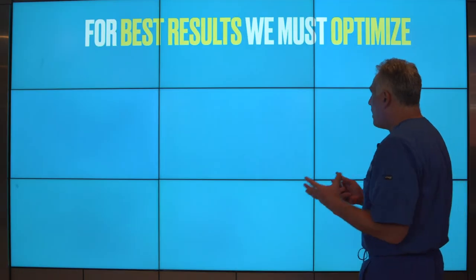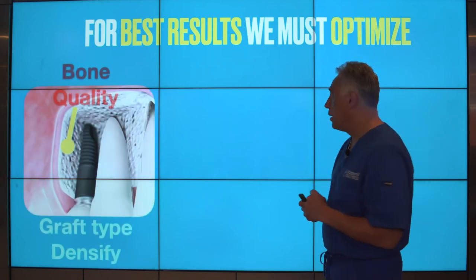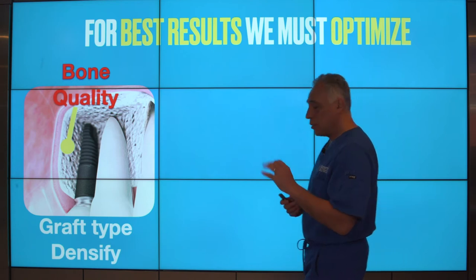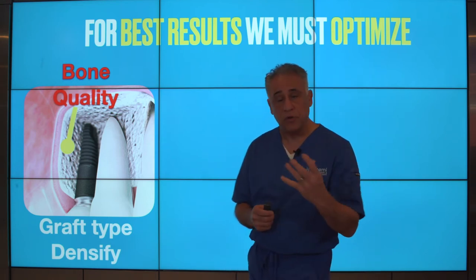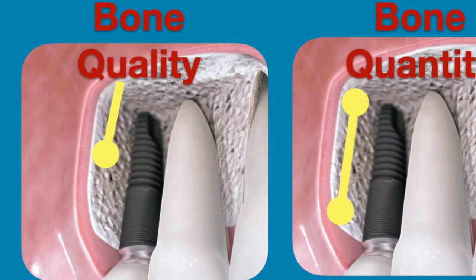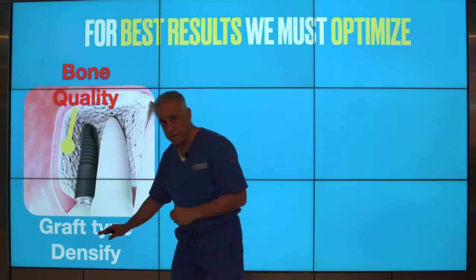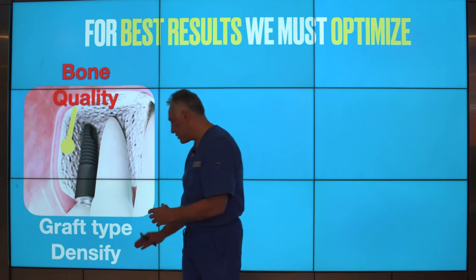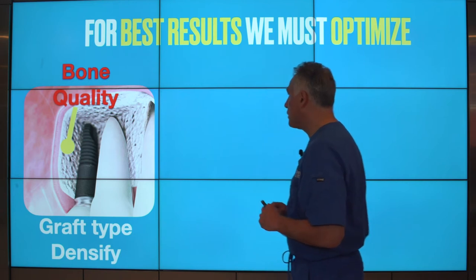Now, for best results, we must optimize certain properties. There are three important properties that we must optimize and make sure that we have for a complete success. The first is we need to have excellent bone quality. How do we do that? By the type of bone graft that's placed, and also how it's placed, a technique known as densification, which we'll talk about in a few moments.